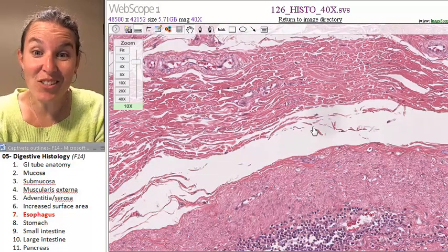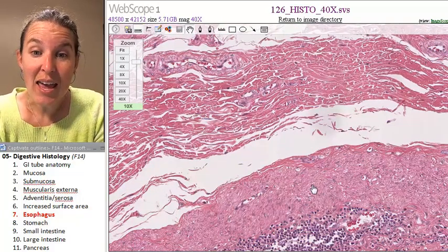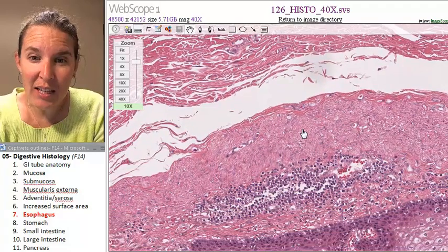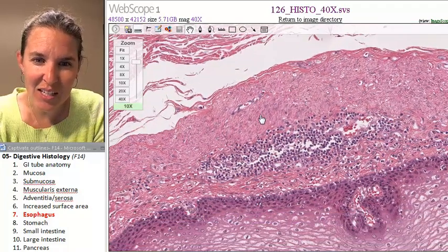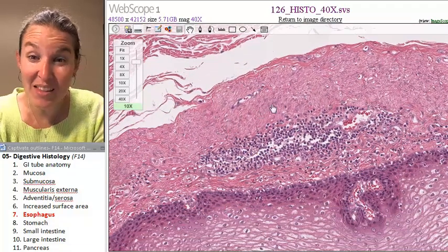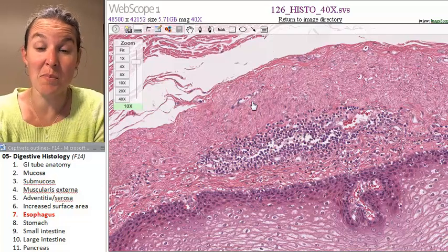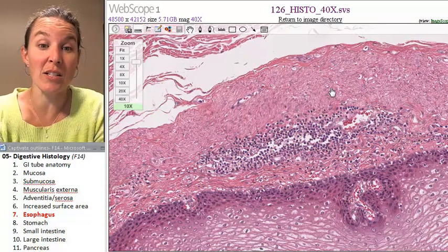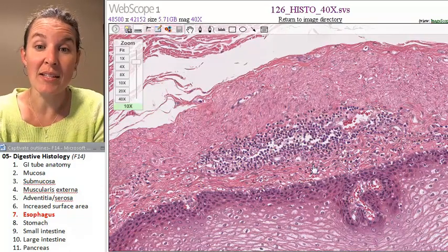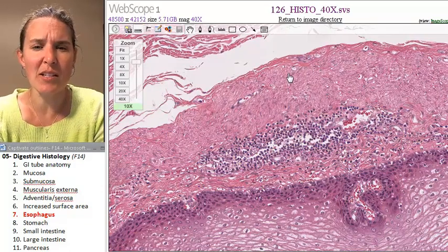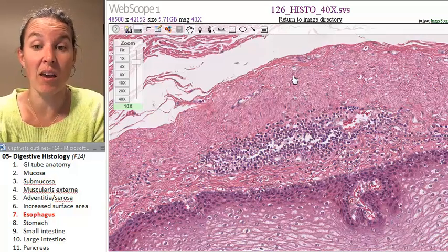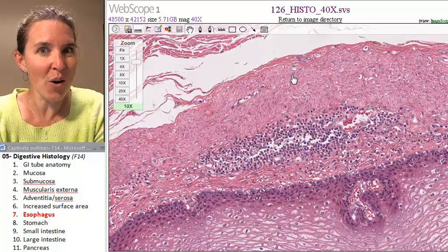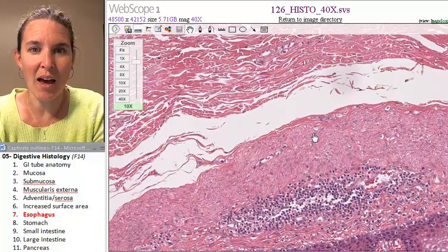That's your submucosa right there. I would guess this might actually be my muscularis mucosae right here, and this is my lamina propria. The muscularis mucosae in this one actually looks pretty thick. You're not always going to have it be that clear.